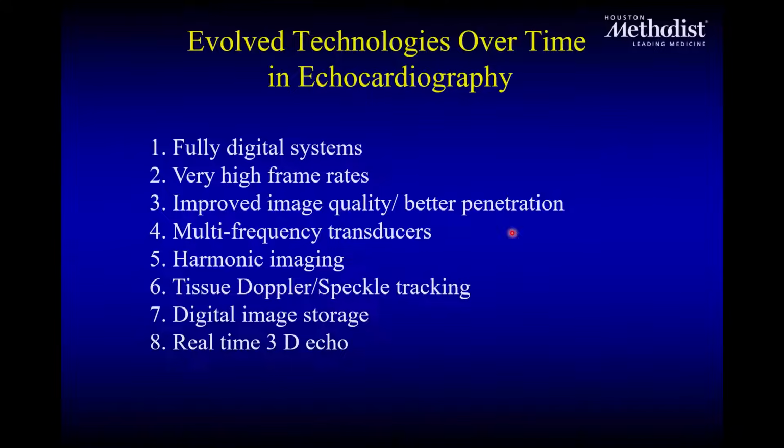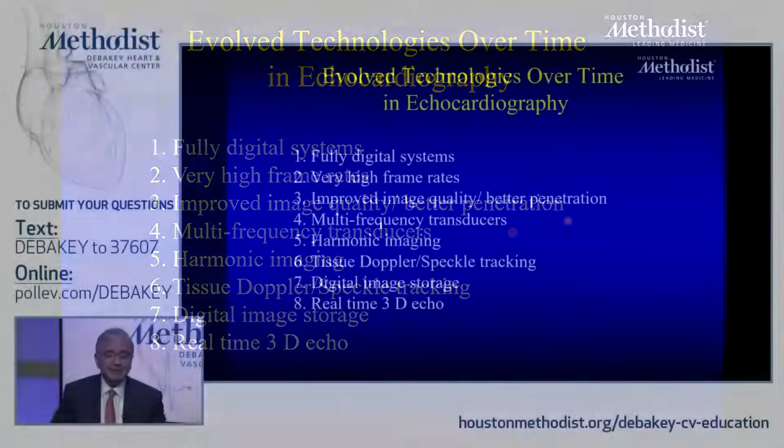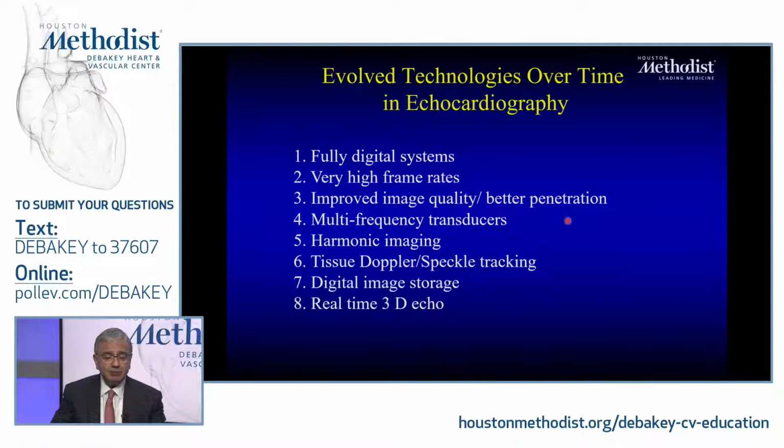Technology has evolved. If you've been in the field for many, many years, it really is amazing how much advancement there has been from a technological point of view. Before the year 2000 or so, there were no fully digital systems, and high frame rates we were kind of struggling with.